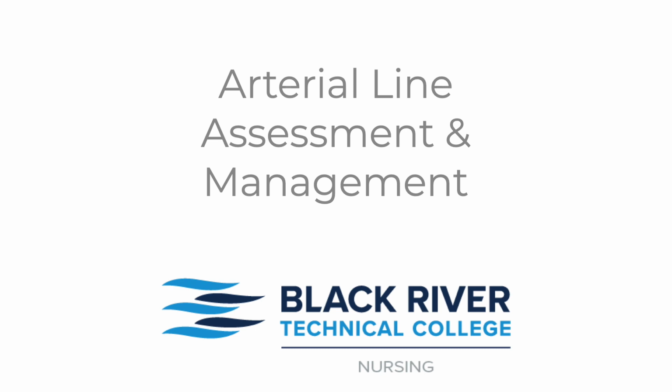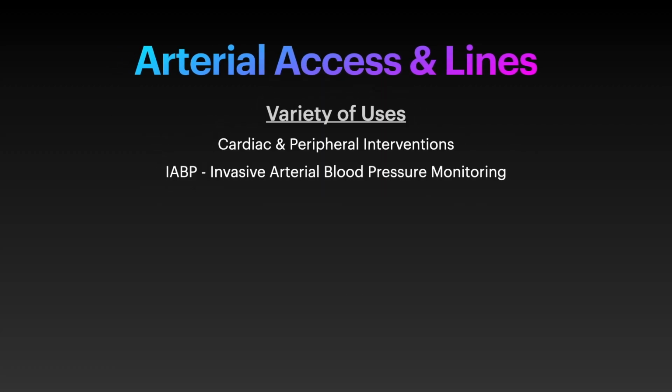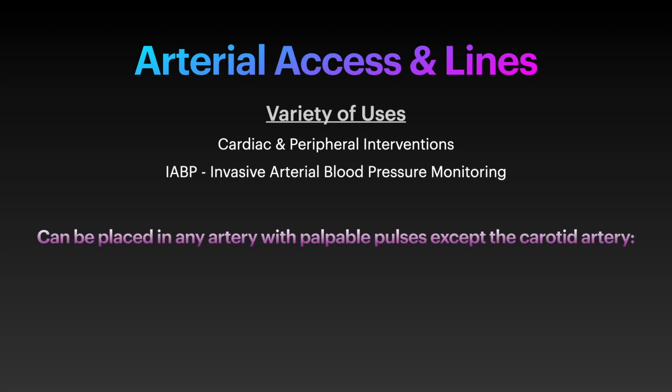Today we're going to review introductory arterial line assessment and management, including blood specimen collection. Arterial access and lines have a variety of uses, including cardiac and peripheral interventions, IABP or invasive arterial blood pressure monitoring.